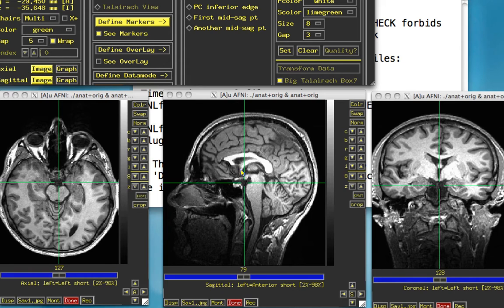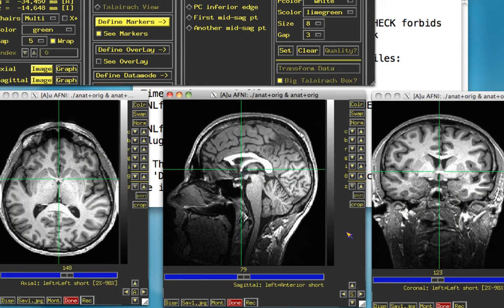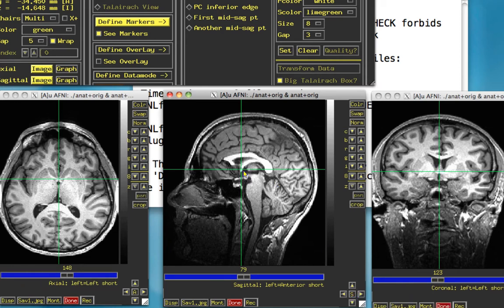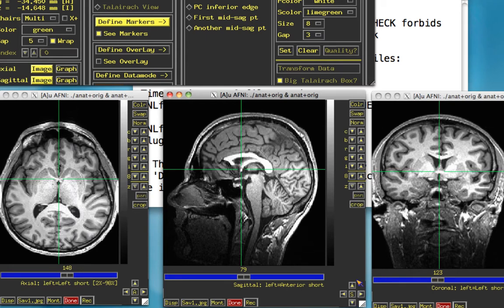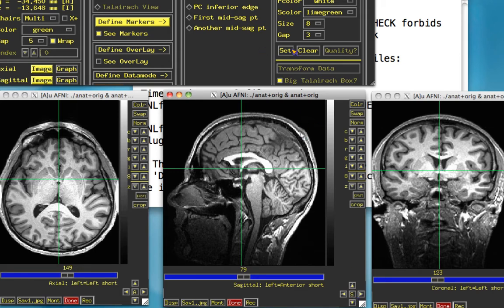The anterior commissure is at the base of the fornix, right about here. If you want to get more accurate, click on the Close Open Crosshairs Gap — the middle button in all three panes — and we want the very top edge of it. Click in the pane and use the arrow keys to move up and down one pixel. Go up until you cannot see the anterior commissure in the axial transverse section. Go back down one, and you can see the anterior commissure starting to come into view. Mark that as the AC Superior Edge — close those crosshairs and click Set.